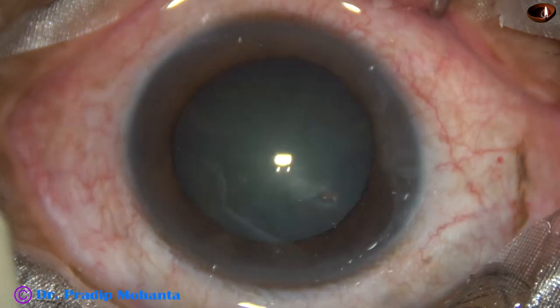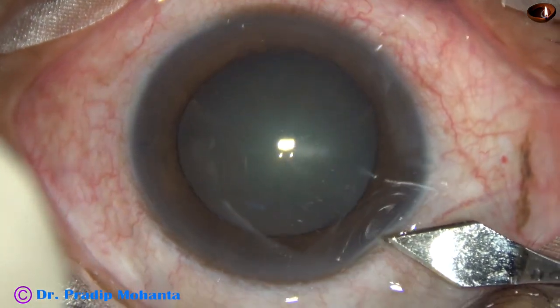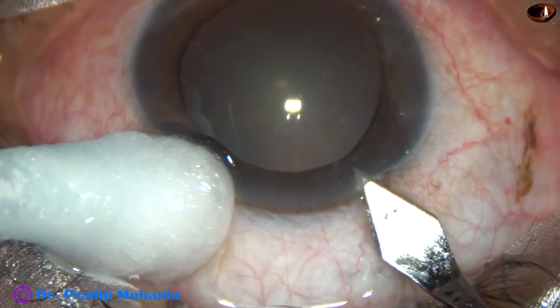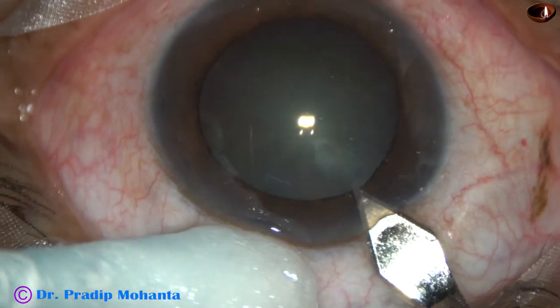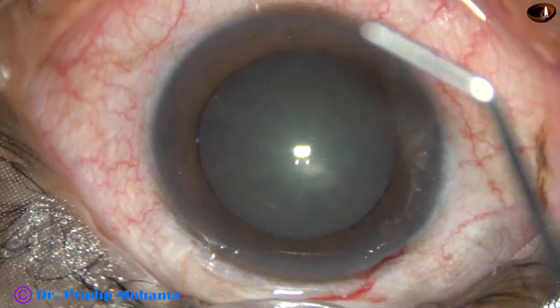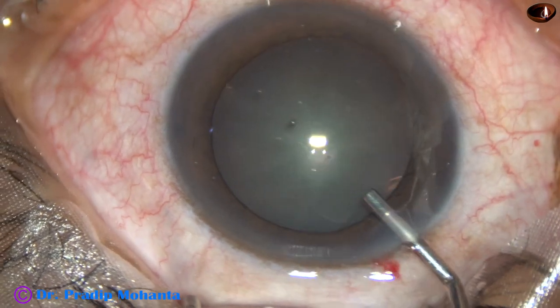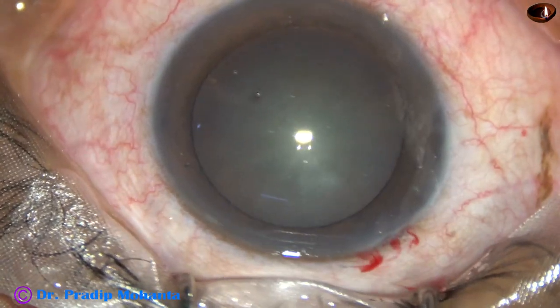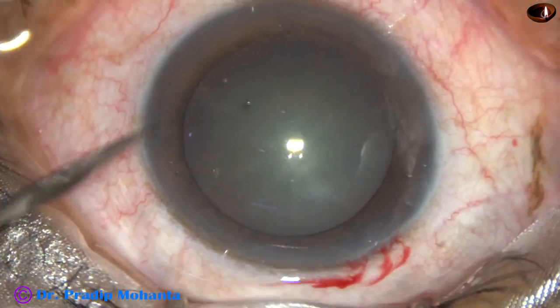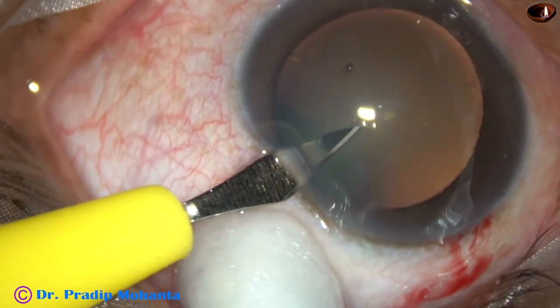This is a routine unedited PHACO under topical anesthesia. This is the main incision with a 2.8 millimeter steel keratome on the posterior aspect of the limbus. 2% hydroxypropyl methyl cellulose is injected into the anterior chamber, and then one side port is made on the left side of the main incision.